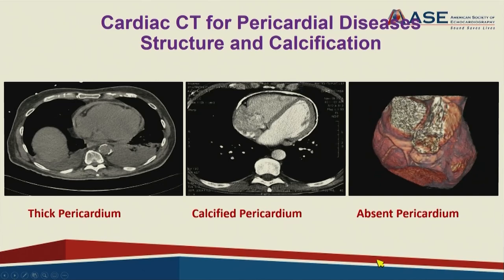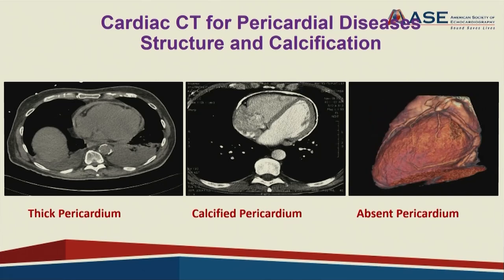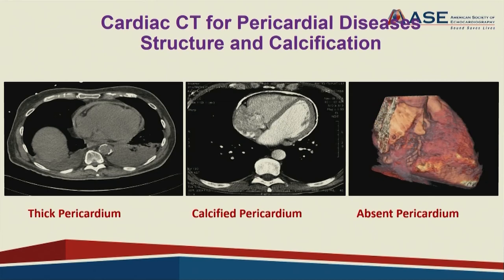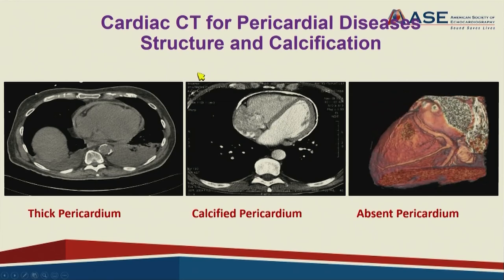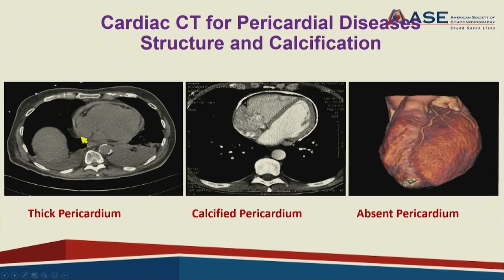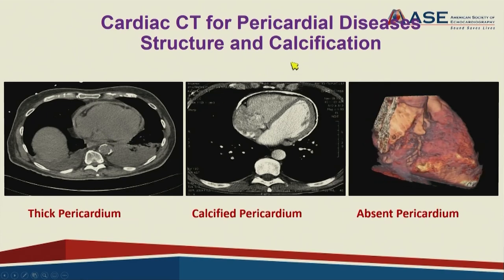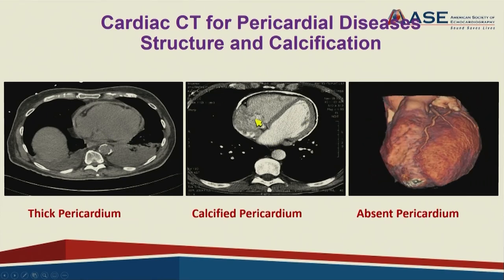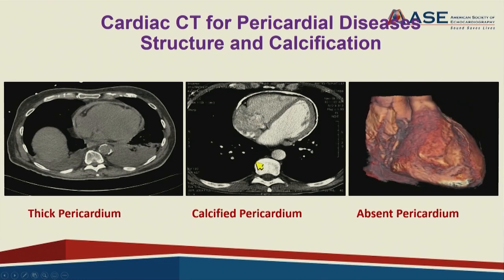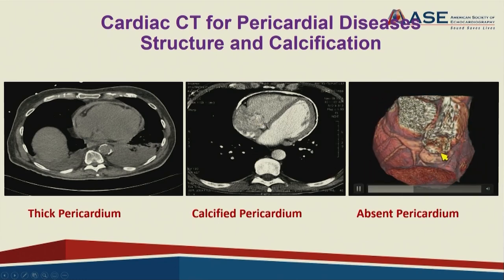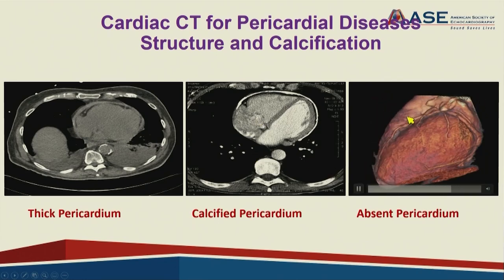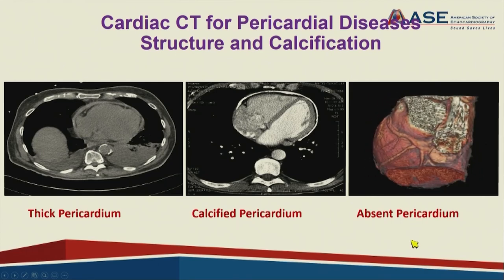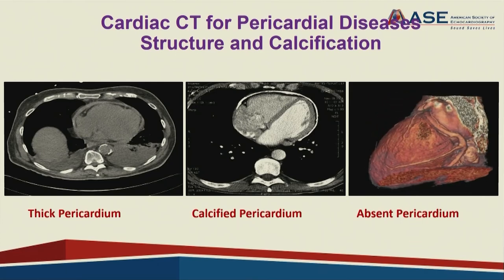Cardiac CT is really fantastic for delineating structure. Here you can see thick pericardium and calcification in patients with constrictive pericarditis. CT can also show absent pericardium in this 3D rendition, which makes it very useful.